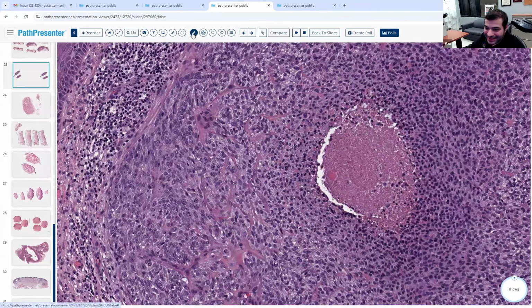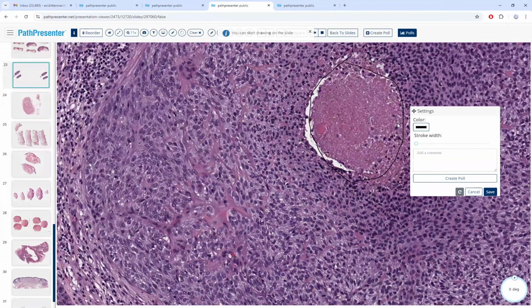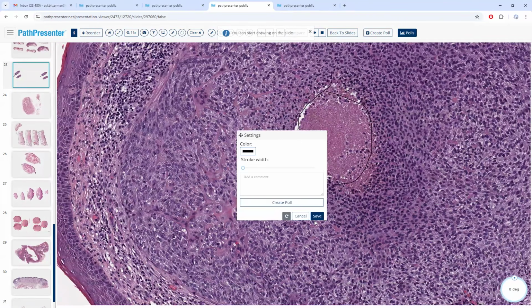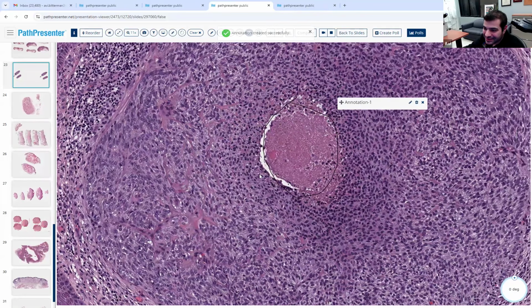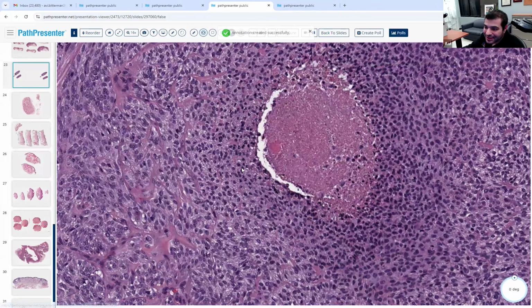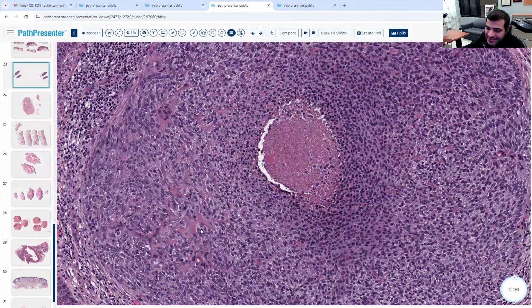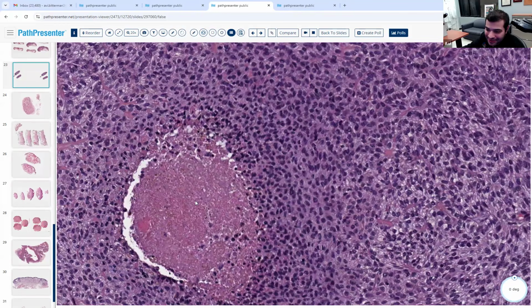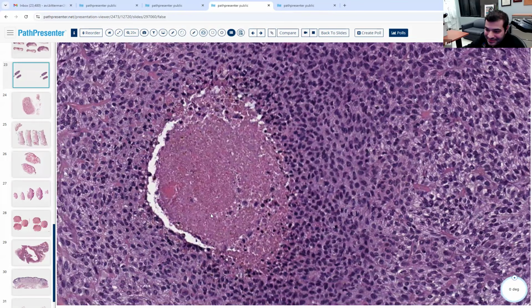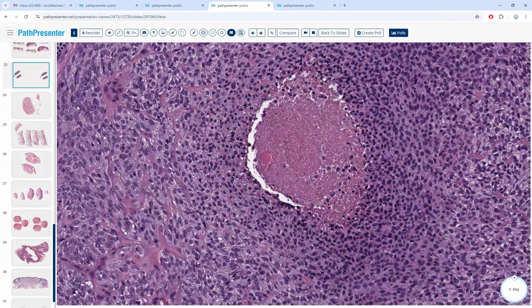But yeah, so I don't know if you were referring to this thing or you were referring to these things. Yes, that's what I'm pointing at, like the center, like a red. Oh, yeah, no, this is just the necrosis en masse. That's just dead cells that have outgrown it. This area is the desmoplastic stroma. This area is the necrosis en masse. You see the difference? Yeah.